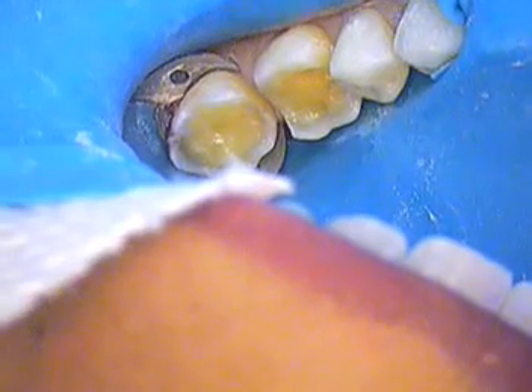Nothing like working under a rubber dam — patients are below the rubber dam. I'm going to cure these for 20 seconds each. For the dentists out there, you can actually see if you've got any residual decay by shining a very high intensity light through the tooth — you can see if they're still compromised. I've never hesitated to go back in and remove more decay if I saw it while using the bonding light.